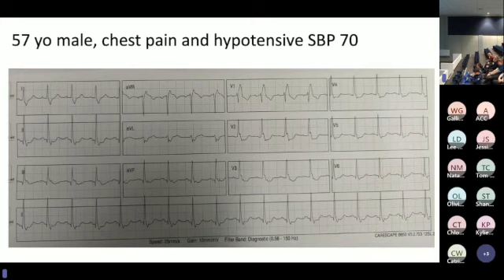Yeah, I would just be echoing this patient. And that would be how I'd be making my diagnosis. Got a hand up at the back.